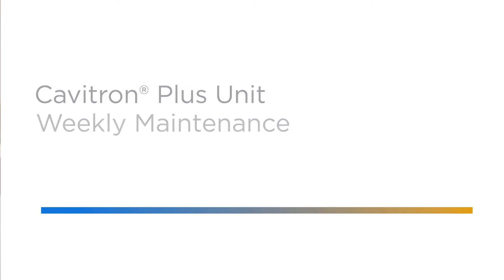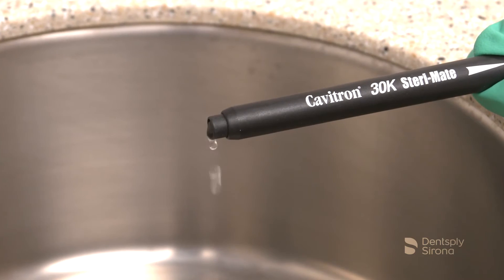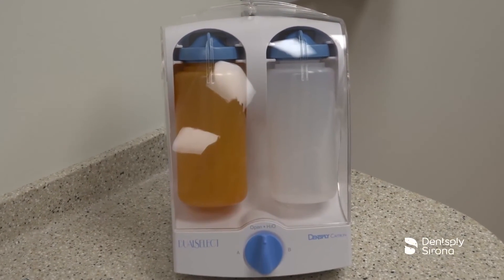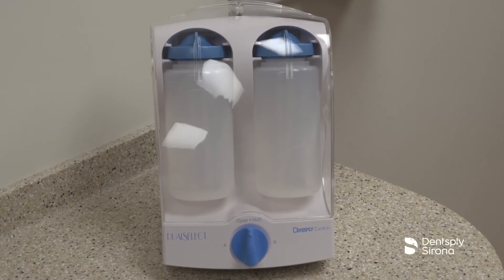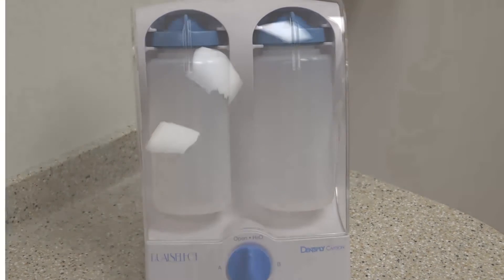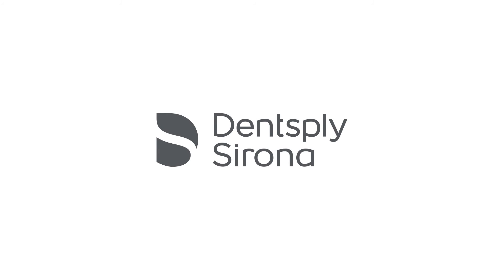It is strongly recommended that the Cavitron scaling system be disinfected by chemically flushing the water lines with a 1:10 sodium hypochlorite solution at the end of each week. This can be accomplished by connecting the device to the Cavitron Dual Select dispensing system. Follow the steps listed in the Cavitron Plus Ultrasonic Scaling System Directions for Use Manual. Thank you for viewing this instructional educational video brought to you by Dentsply Sirona.